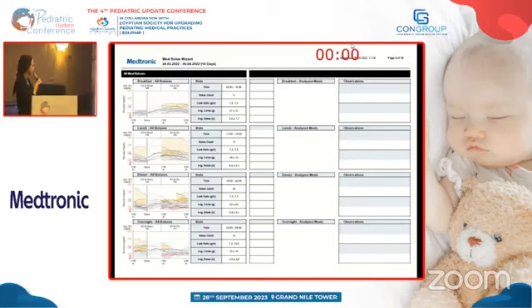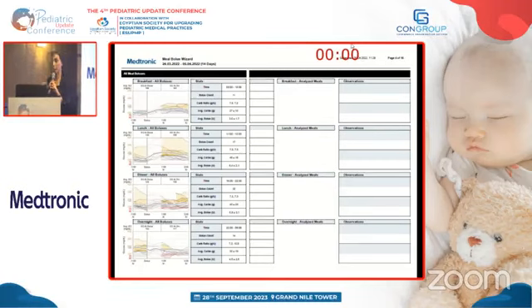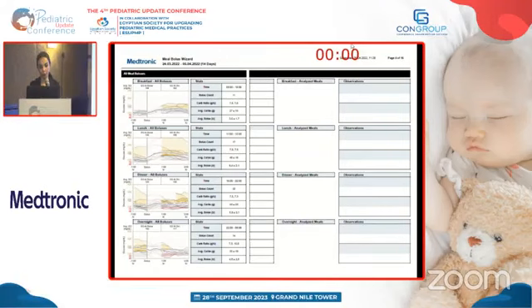بعد كده هلاقي إن في الأوقات اللي بعد كده في الدينر فور اكزامبل هلاقي إن الإنكريز مش بنفس قوة الارتفاع، يبقى ساعتها ممكن أعمل سبلاتنج للكارب ريشيو. لو أنا عندي كارب ريشيو واحد فور اكزامبل على مدار اليوم، ساعتها هبقى محتاج إني أكونسيدر إني ممكن محتاجة في فترة البريكفاست واللانش إني أقلل الكارب ريشيو، وأكيب الكارب ريشيو ذا سيم فور ذا دينر لأنه ما فيهوش مشكلة والريدنج إلى حد كبير مظبوطة.